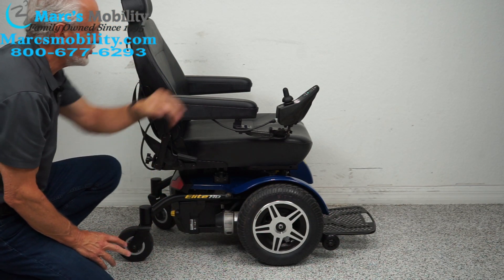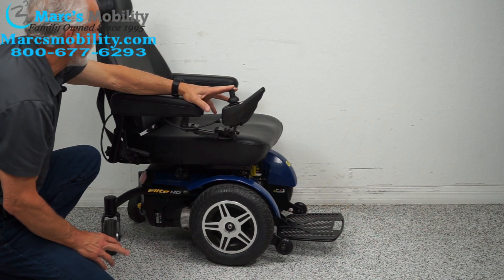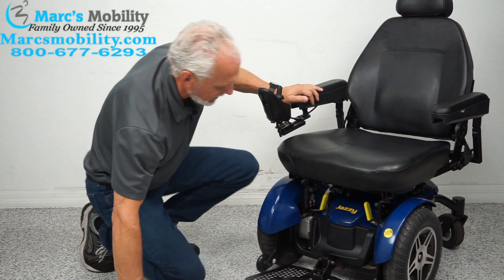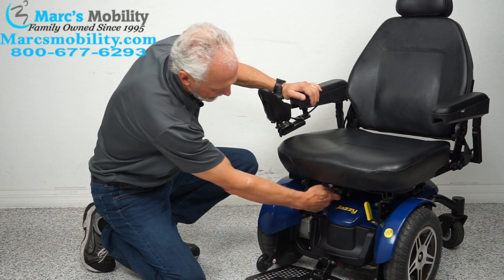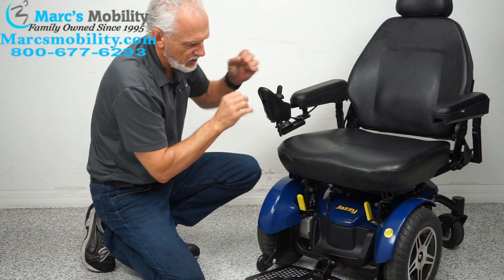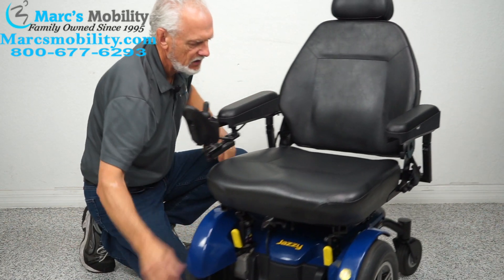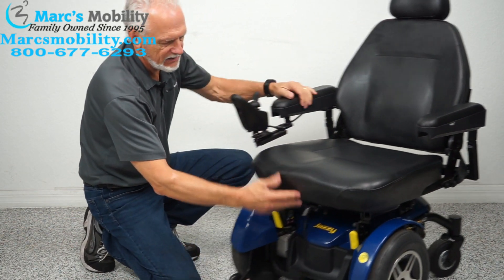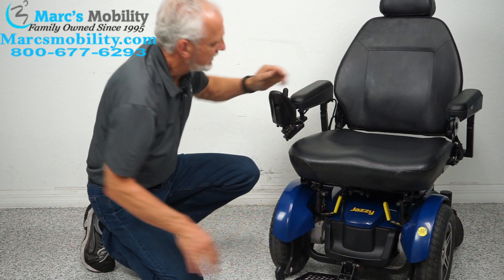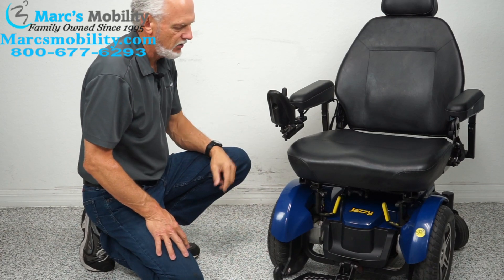This chair is real easy to put in neutral. If you want to roll it around the house for any particular reason, look at the front of the chair — you see this lever. Always turn the power off so you have no resistance, then put the levers forward. Look how easy that is to roll. To put it back in gear, you can hear it click back in. Then turn the power back on.